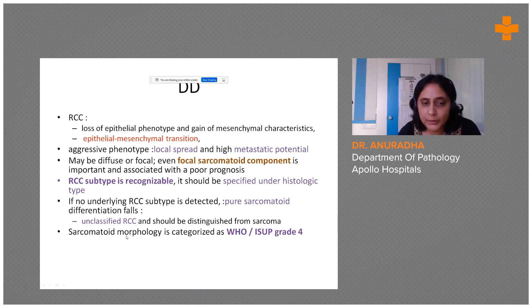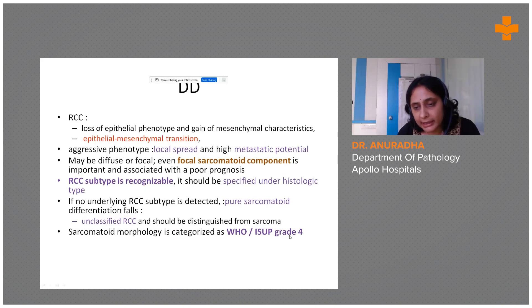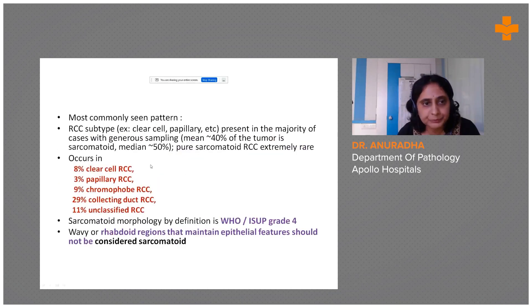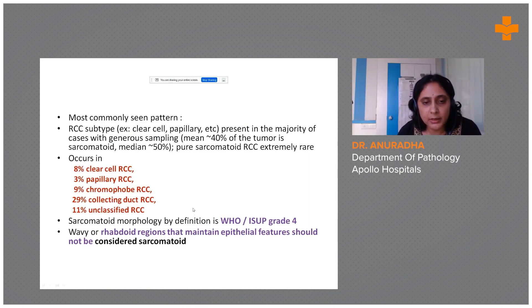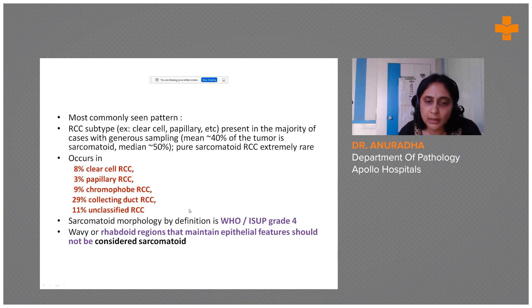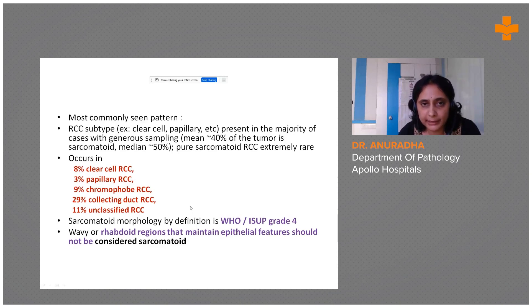All RCCs with predominantly sarcomatoid morphology are graded as grade four. RCC subtypes that can have a sarcomatoid component include clear cell, papillary, chromophobe, collecting duct, and others. Please keep in mind that rhabdoid regions are not equal to sarcomatoid component, but you need to report if there are any rhabdoid areas.